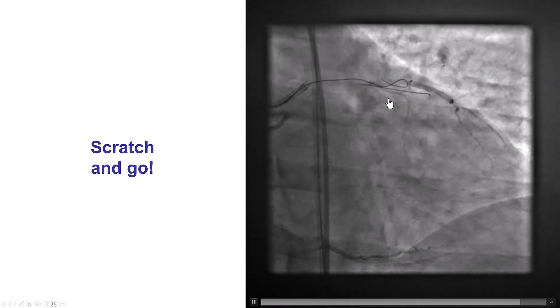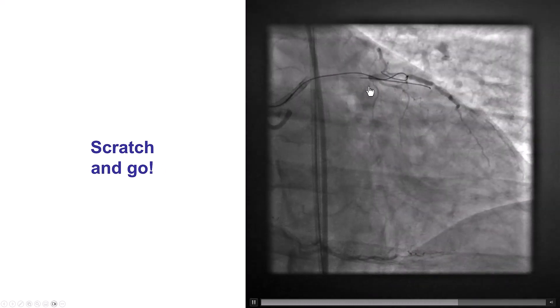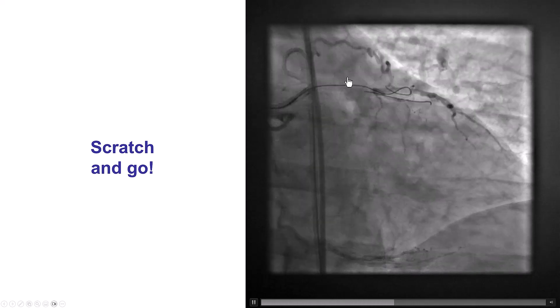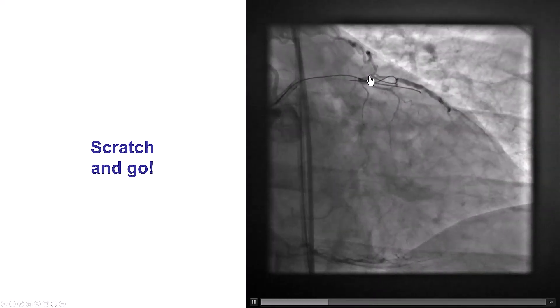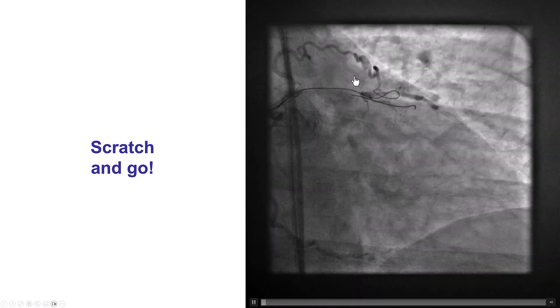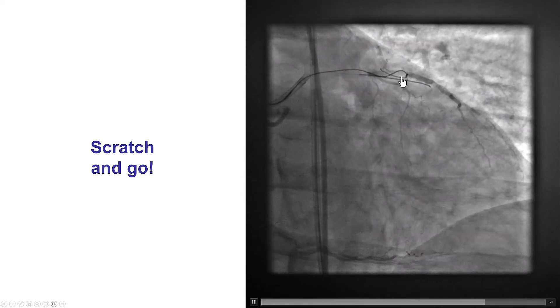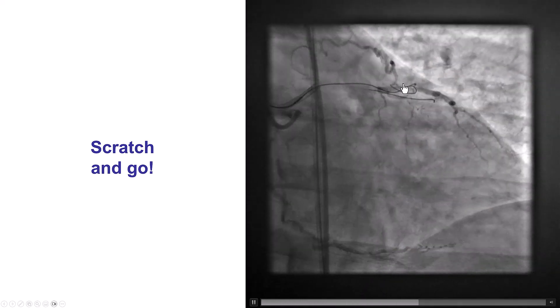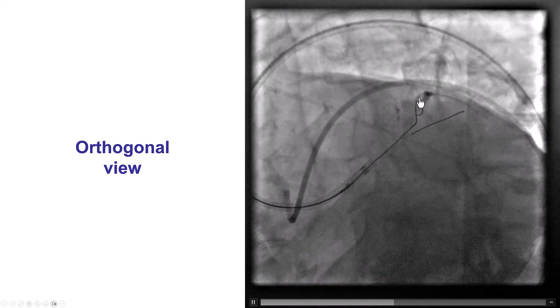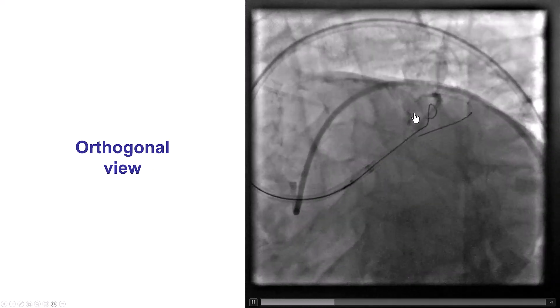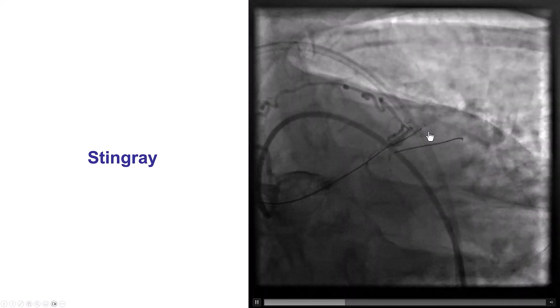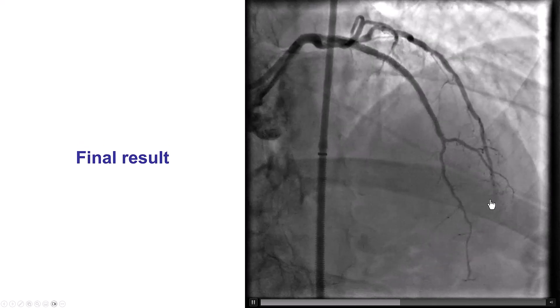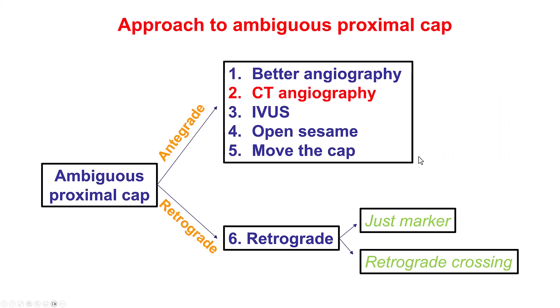In this case, it was still difficult to advance a wire to that area, but having the contralateral visualization, we did the scratch and go technique, created an extra-plaque dissection, and advanced the guide wire along the course of the mid-LAD, followed by confirmation in an orthogonal view, and then successful re-entry with the Stingray system and a nice final result. So taking the time to do a good angiogram can really help clarify the ambiguity of the proximal cap.